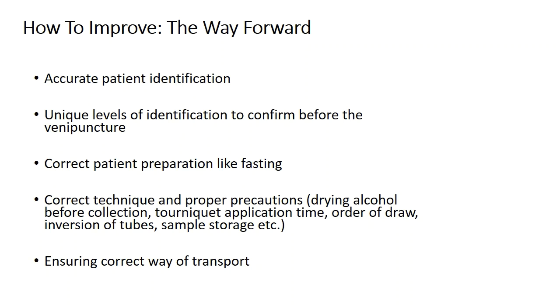We have seen that many laboratories nowadays, for health camps, collect samples maybe at 8 a.m. or 9 a.m., but they are lying under direct sunlight exposure without any proper collection bag, or there was no ice pack. They are lying in direct sunlight, and by the time they reach the laboratory in the evening, the analyte stability has already deteriorated and it will lead to a wrong result. Okay. So these are the ways of improvement.